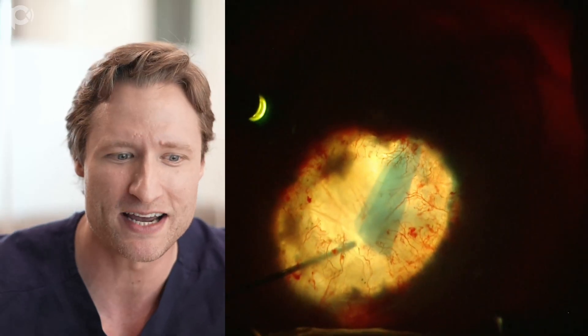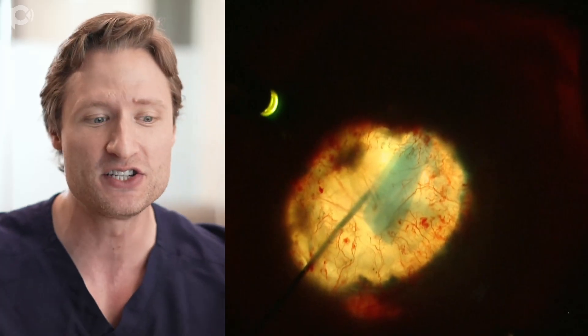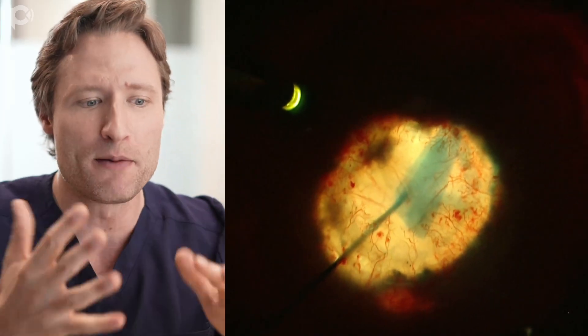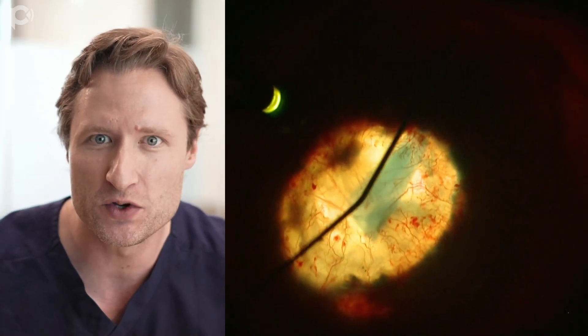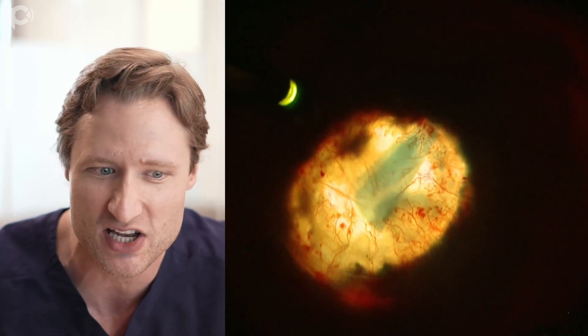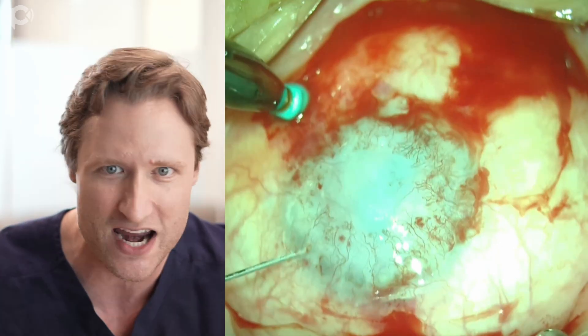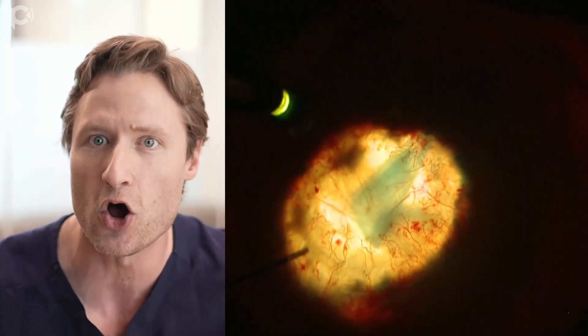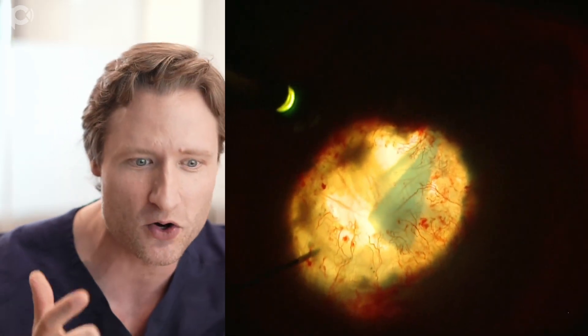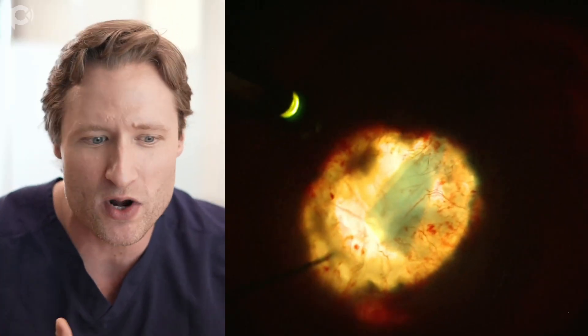What I'm doing now is injecting fluid at the graft to deepen the chamber and tumble the graft over. When the graft is flipping and tumbling in a deep chamber, you can often catch sight of the edges of the curl - the graft will curl into a more favorable configuration. So that's always the first thing I do: inject the graft, then deepen the chamber, let the graft perk up, and see what I'm working with.